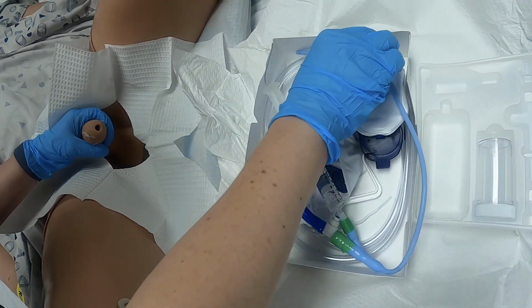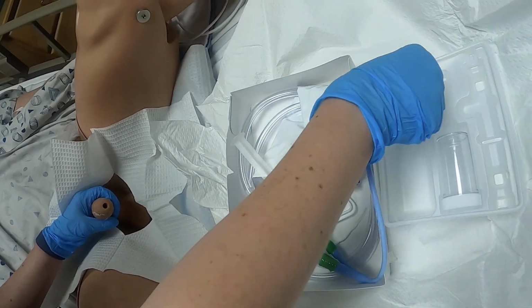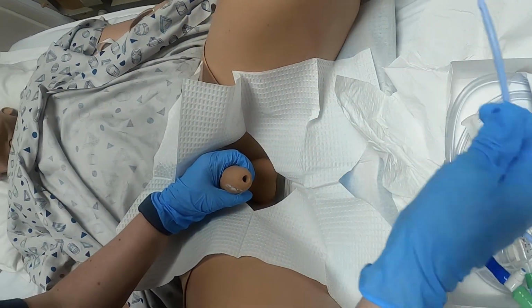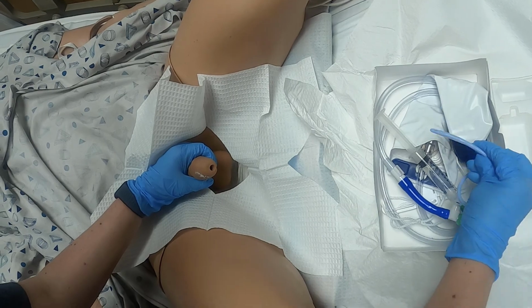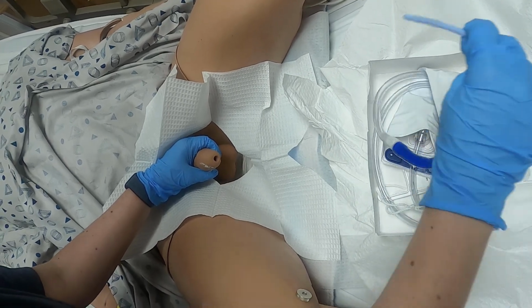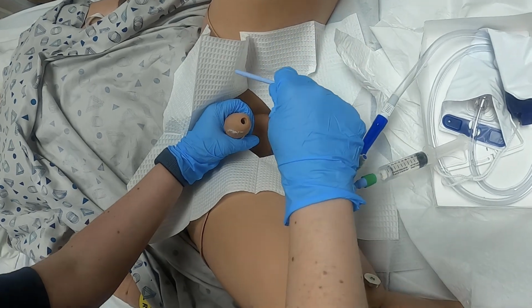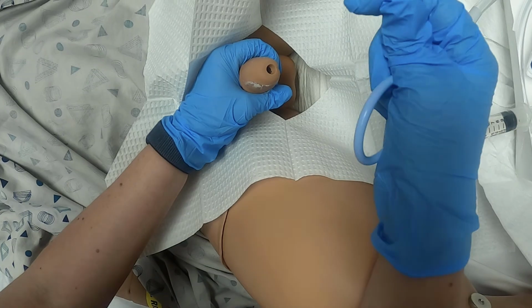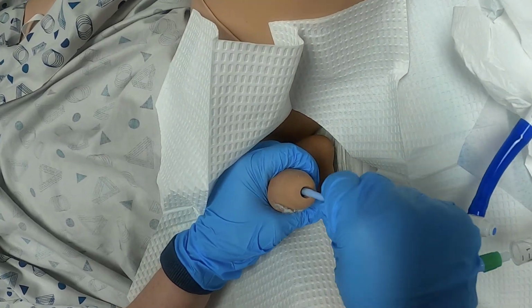Okay, so now we're gonna grab our lubricated catheter. We're gonna lube a little bit more. All right, Mr. Paget, what you're gonna feel is I'm going to take the catheter and I'm gonna insert it into your penis, okay? It's gonna go all the way into your urethra, and I'm not gonna stop until I see urine, okay? Because you had 500 milliliters of urine in there. So here's the catheter tip. I'm gonna insert it now. All right, here we go.